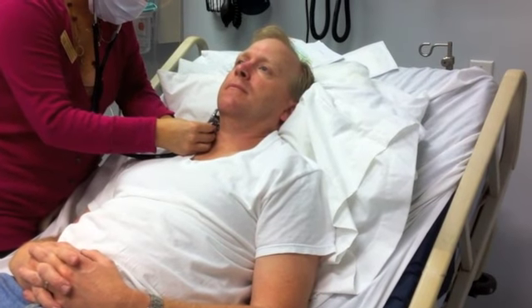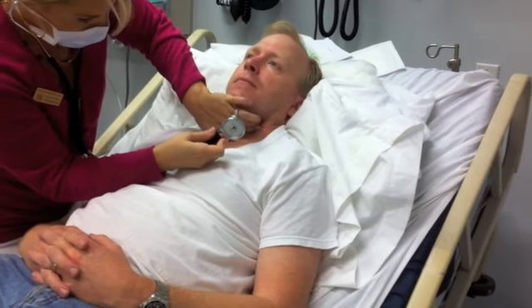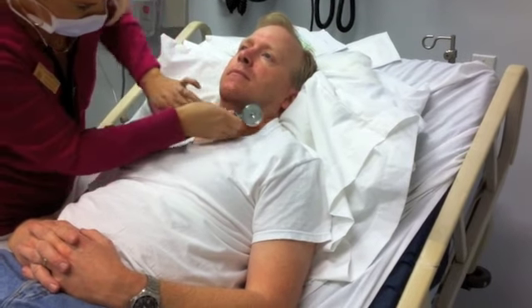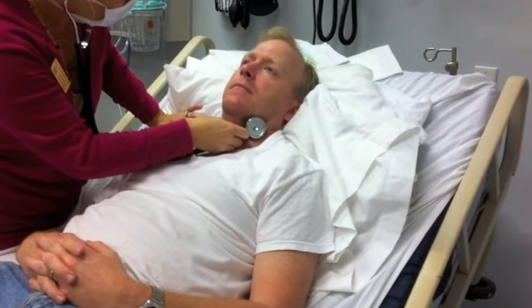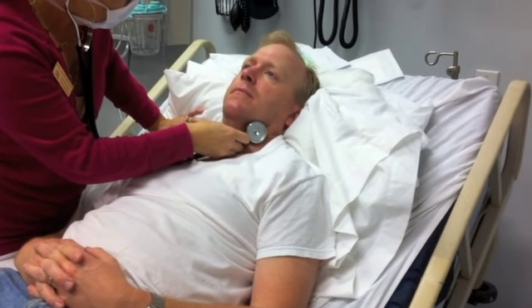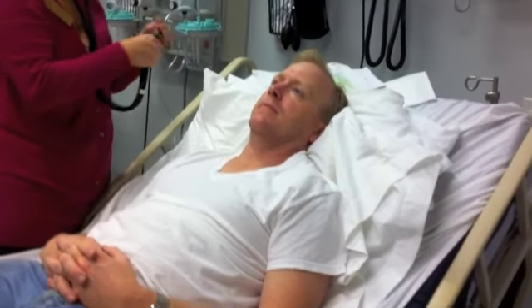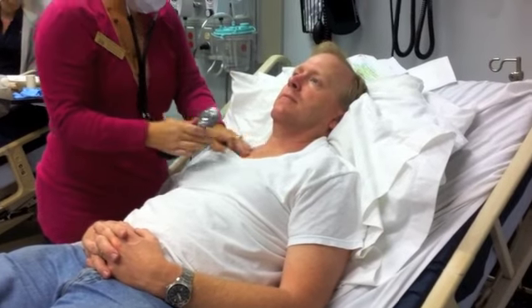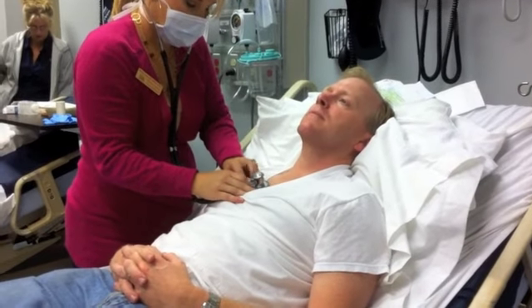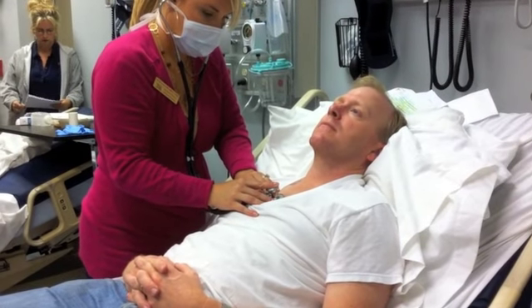Hold your breath. All right, and breathe. And hold your breath. And breathe. Now I'm going to listen to your heart. Just breathe normally.